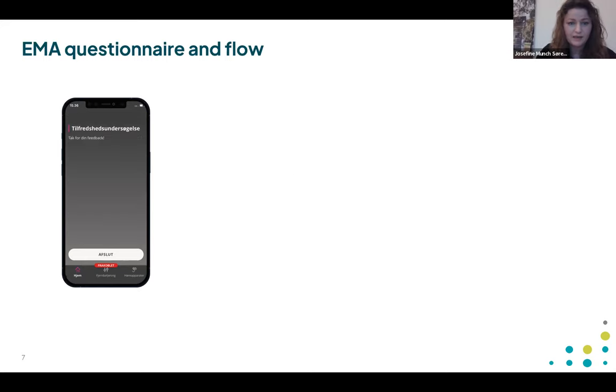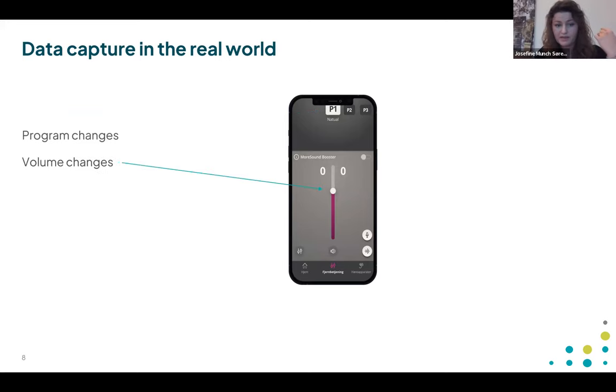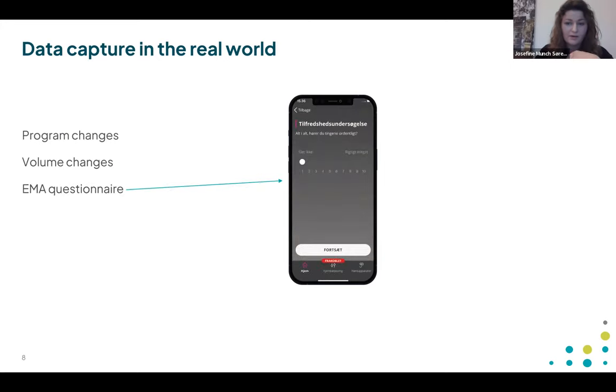And then when they were sent out to the field, what we were capturing was whenever they made a program change in the app or on the hearing aid, whenever they made a volume change, whenever they filled out an EMA questionnaire. And also we, throughout the whole day, captured the acoustic context around them.